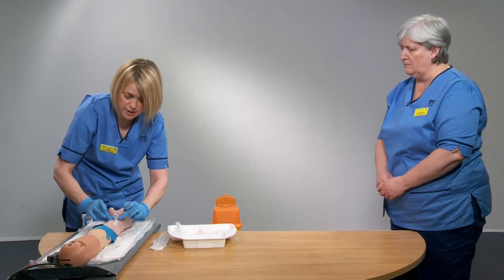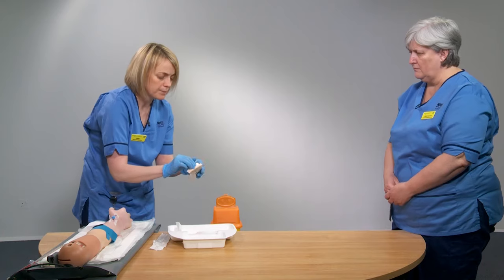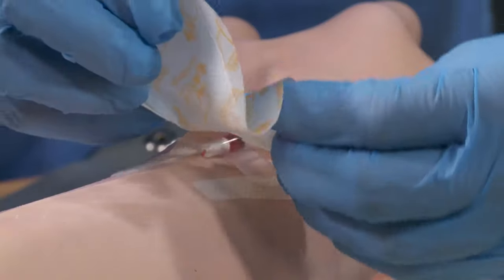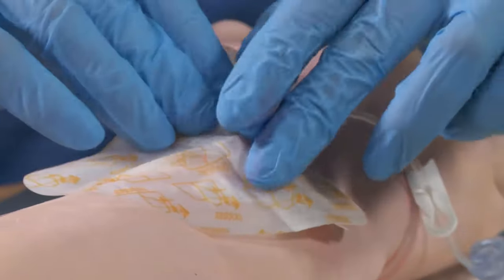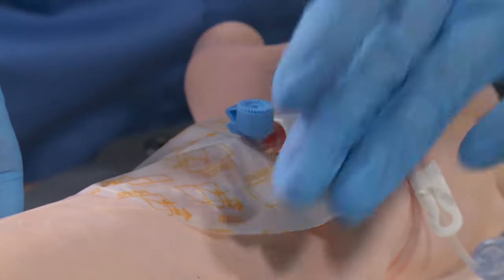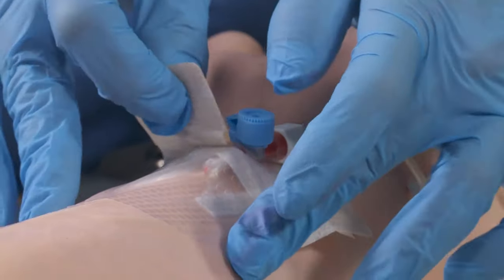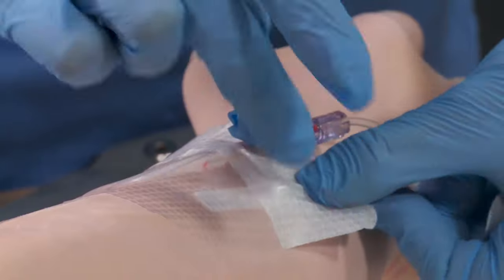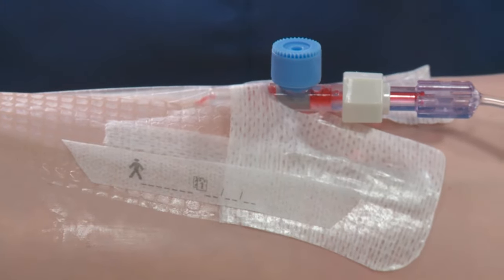Those securing strips reduce the risk of the cannula moving underneath the dressing. Number two is taking the back off and feeding the dressing round — it's really important you can see the puncture site through the transparent part of the dressing, right around the hub of the cannula. Then number four is taking the back end off. You can see it's nice and secure yet the puncture site is clearly visible. Lastly, there's a date and time strip you can place on the side of the cannula dressing — again, making sure not to obscure the puncture site.